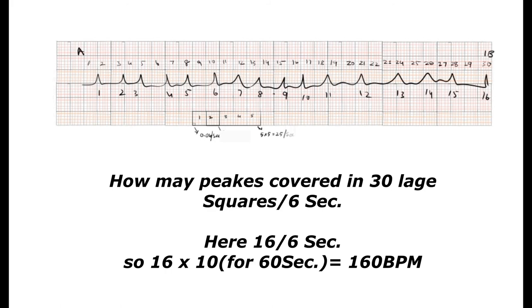Here we have 16 peaks counted in 30 large squares. So for 60 seconds, 16×10 equals 160 beats per minute. This is how we calculate heart rate based on the ECG.